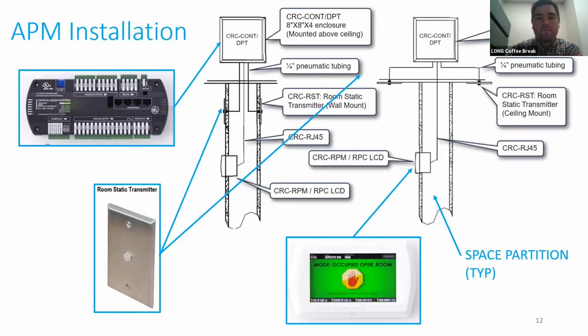Okay, so we know where they're going and how many we should have. As far as the installation process, it's not overly complicated. Steve, I know you've worked on a bunch of these over your career here. Can you go through with the group and explain how these are installed and how easy it is to install these? So there's a couple of ways that pressure monitors can get installed.